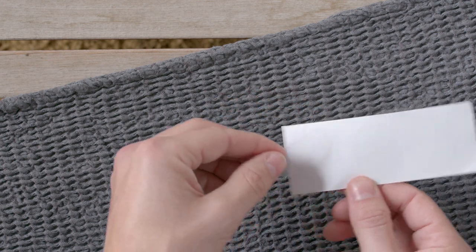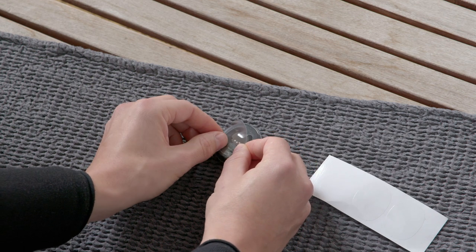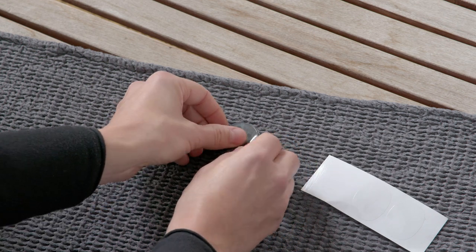Place the round adhesive strip over the flat side of the processor, starting at the circular flap. There should be no gaps between the strip and the cover.